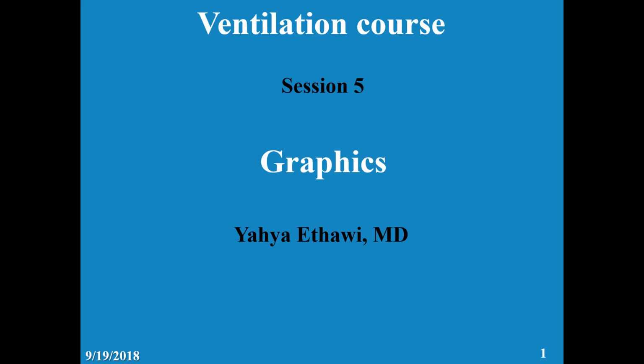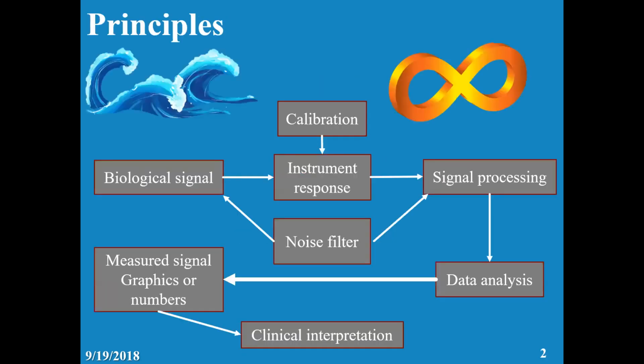So it shows us the trend. And the graphs or graphics are very important because they are continuous and non-invasive and show the trend, the changes over time. So it's very important for somebody ventilating, an intensivist or a nurse, to understand how to look and when it's alarming and when you interfere.